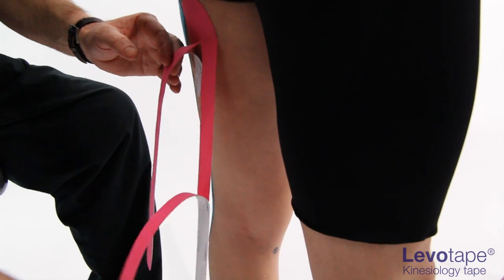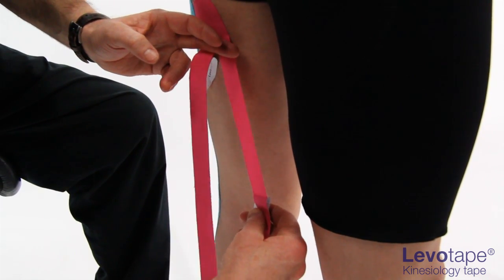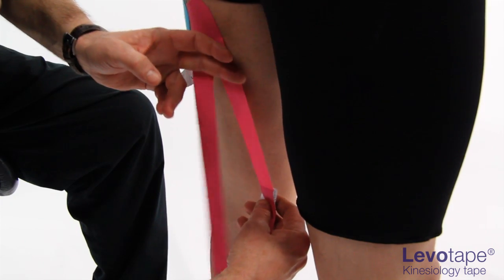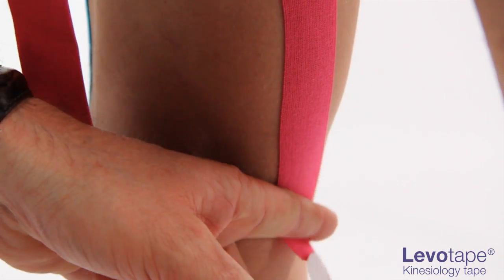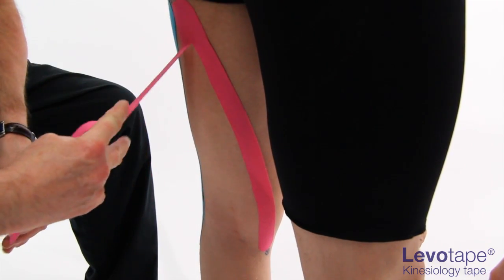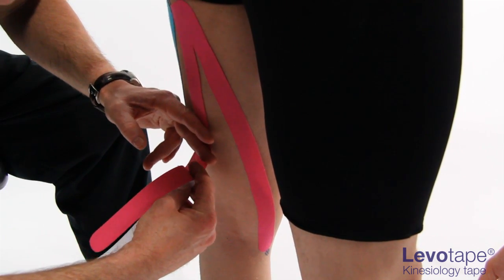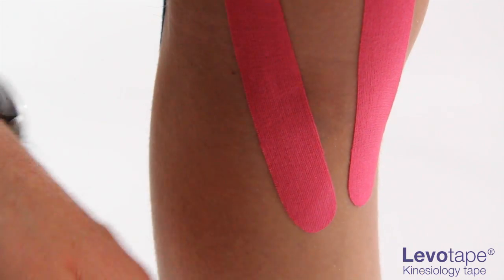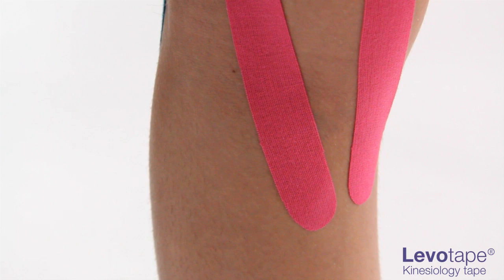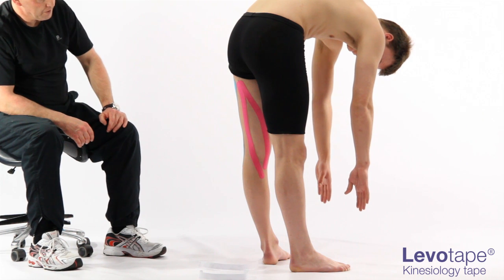Lay the lateral tail along the outermost edge of the semimembranosus with absolutely no tension. Lay the medial tail along the outermost edge of the semitendinosus. The end of each Y tail converges at the tibial end point. Return the patient to neutral.